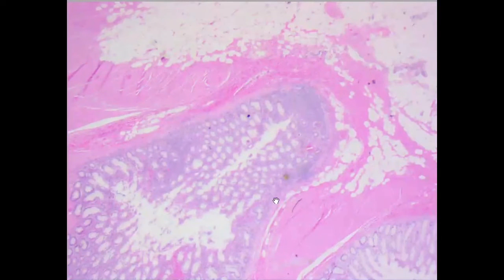And this is another outpouching. So again, the submucosa and mucosa went and penetrated the muscularis propria, which is shown here as one part and the other part. This is the bulky muscularis propria. Maybe the last slide here to show you.